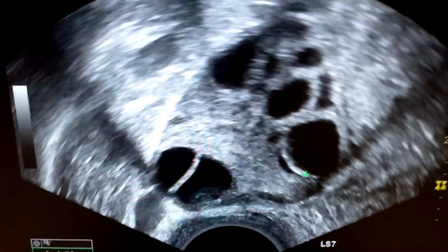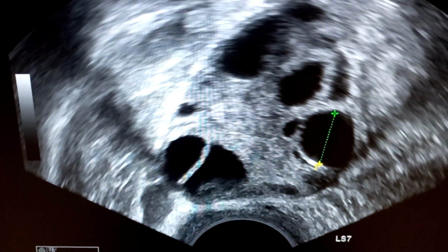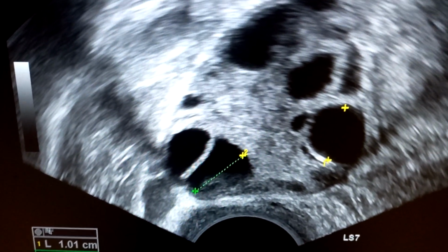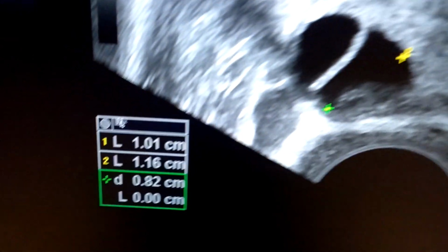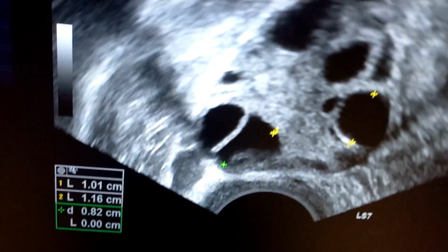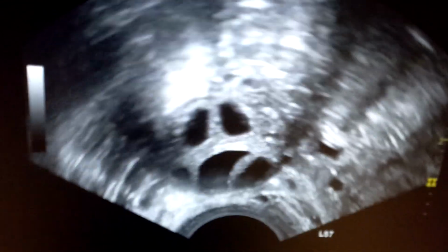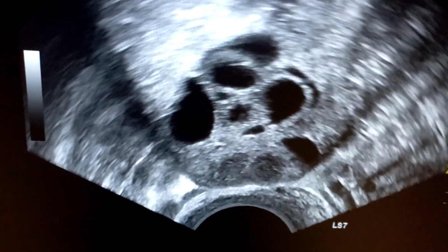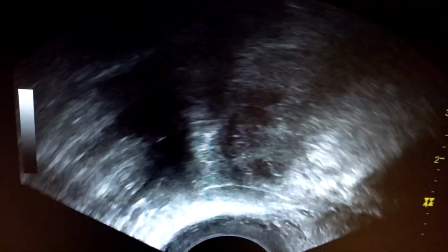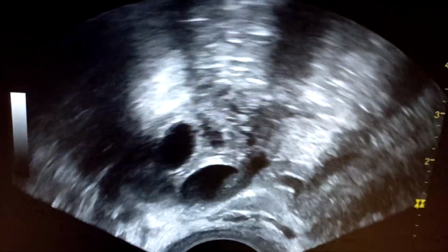An even cohort means if you measure the size of these individual balls or follicles, you can find that the size is almost the same. Over here I have just taken the sizes. You can see one is 10 mm and one is 11 mm in size. So in biology 10-11 mm is considered similar. If you count the number of follicles over here, there are almost 15 follicles in this ovary. Polycystic ovary patients respond very well to IVF stimulation as compared to the other types.